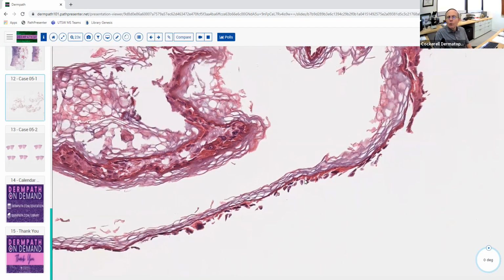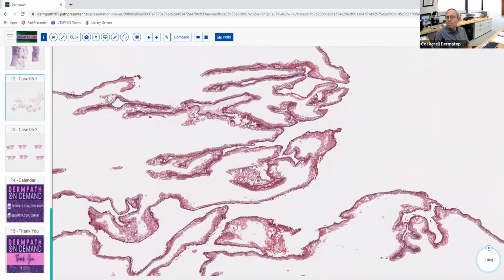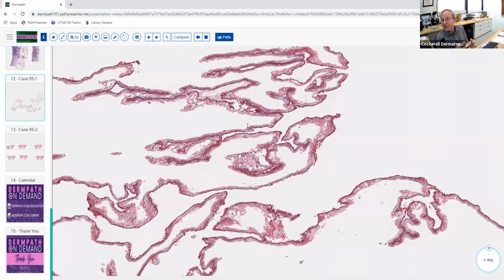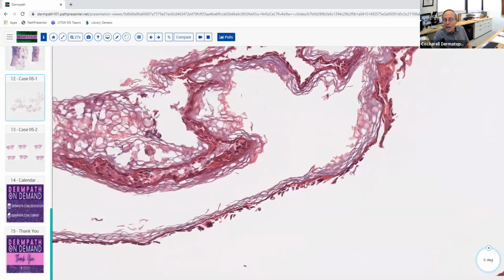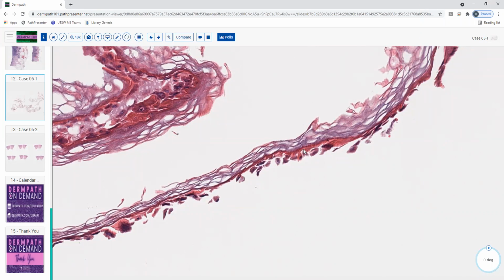And when they bring you down to the frozen lab, this rolled up piece of sloughed skin, and they ask you to look at it, what's the differential diagnosis that they're mainly asking you to distinguish? There's two main things. SJS and TEN. Good, SJS/TEN. And then what's the other entity? Pemphigus vulgaris. Well, not usually for an acute situation.